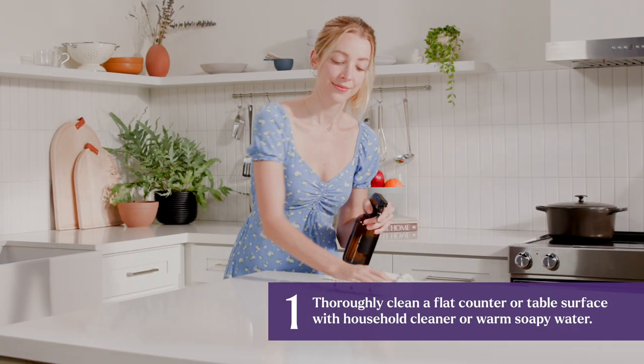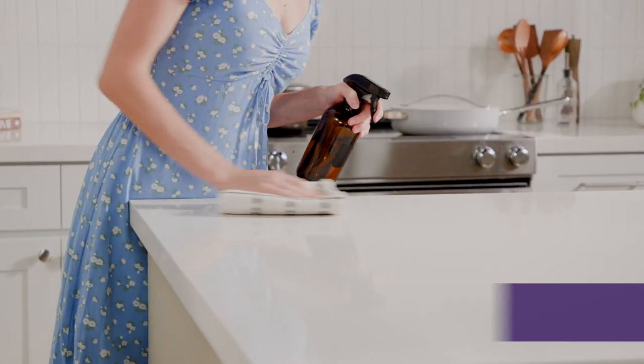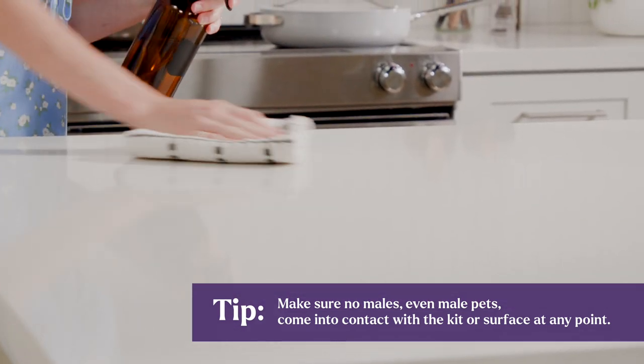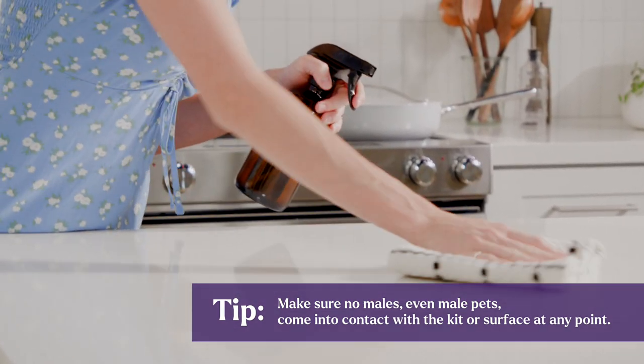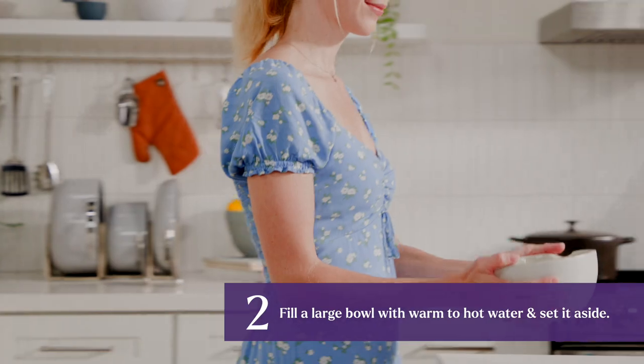Thoroughly clean a flat counter or table surface with household cleaner or warm soapy water. For the remainder of your test, make sure no males — even male pets — come into contact with the kit or test surface at any point. Lastly, fill a large bowl with warm to hot water and set it aside.